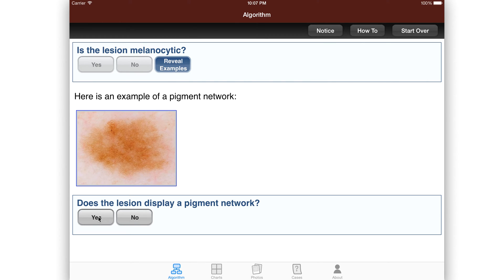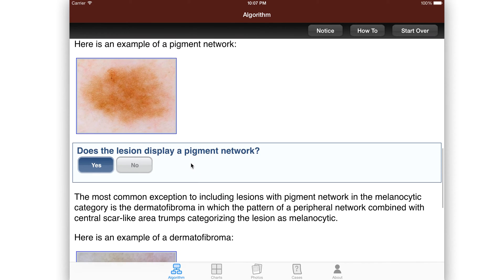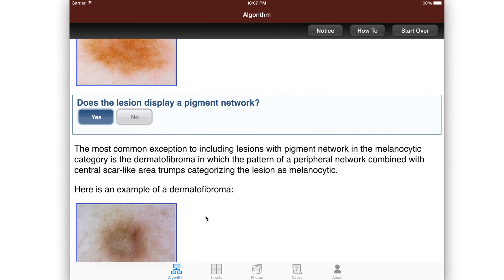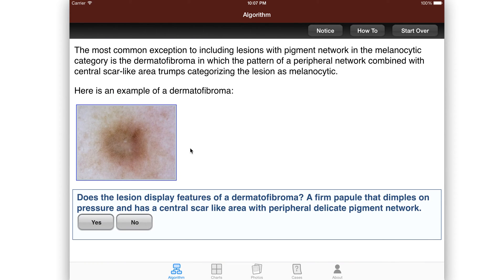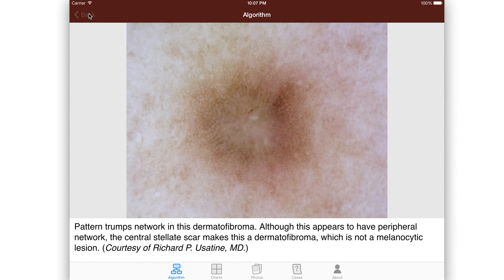You can reveal examples if you're not sure and you want to see what exactly we mean by pigment network. And then you can specifically answer it question by question. So is there pigment network? If so, it gives you some of the exceptions such as dermatofibroma. If you want to see the image larger, you can do this and see a nice image of a dermatofibroma with a little pigment network, but actually not melanocytic. So it has a pattern of a dermatofibroma, but is not melanocytic. That's one of those exceptions.